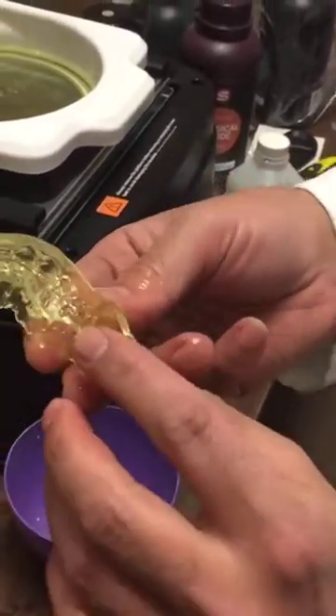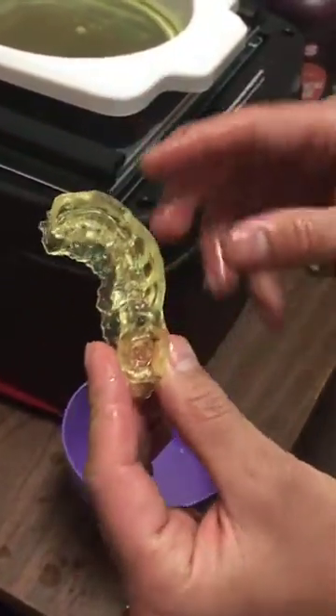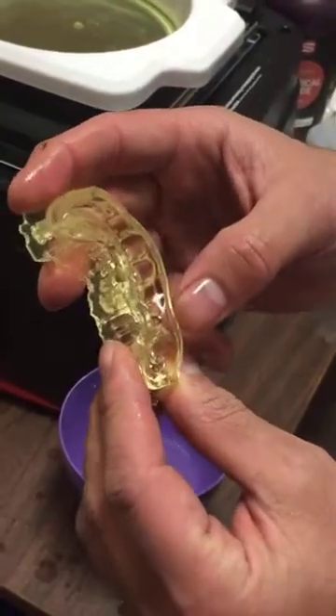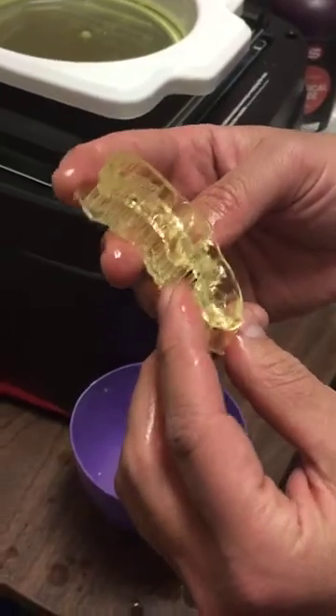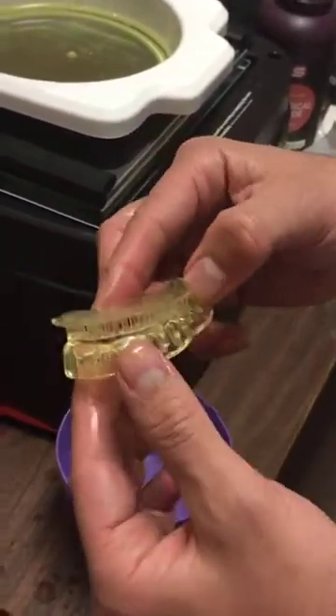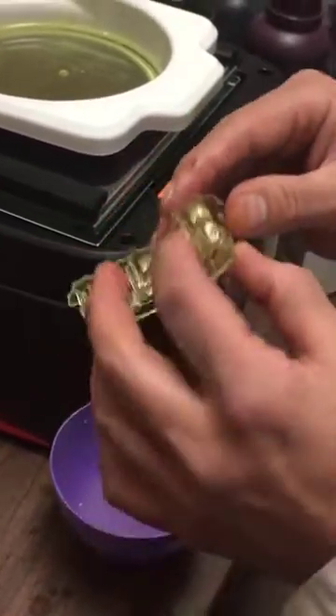You can see that we have the access hole for the implant site that we are going to go ahead and do. We are using a Blue Sky Bio implant in this case, and we're going to put a sleeve — a metal sleeve. So I'm going to try to trim it out.